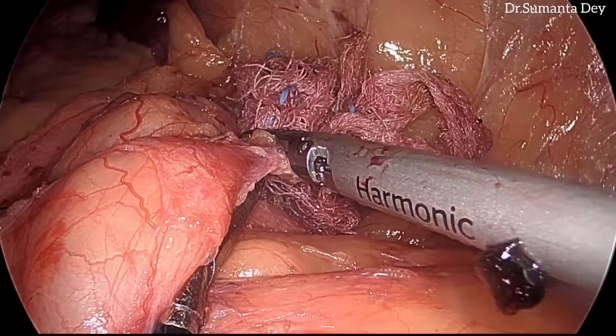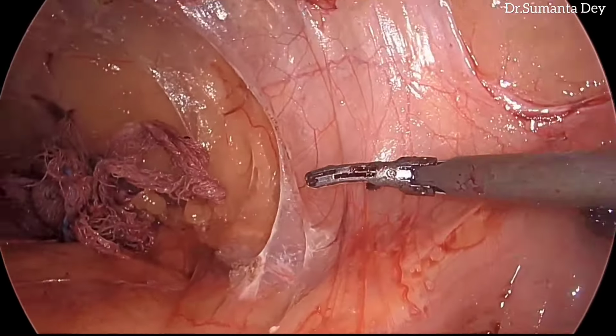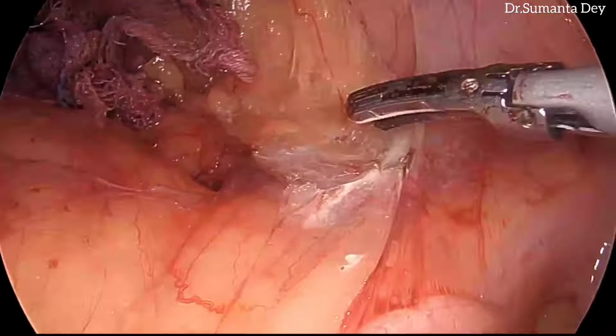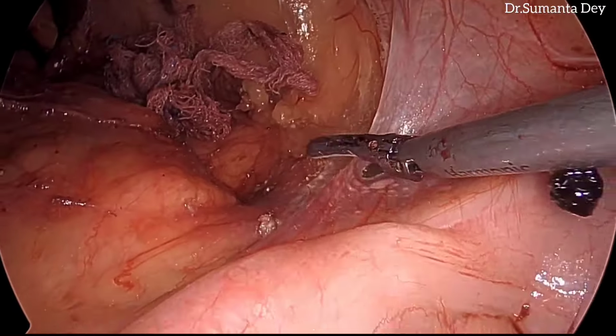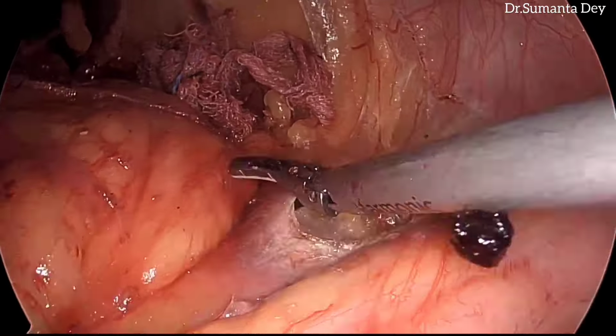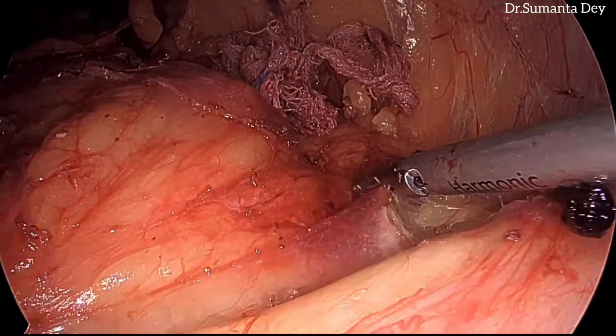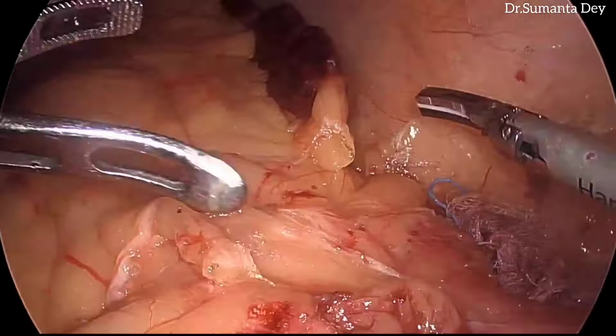So just by dividing the lateral attachments, the complete left colonic mobilization is done till the start of the sigmoid colon. Till the starting point of the sigmoid colon, it is being mobilized nicely, so that once it is completely mobilized, we can do a tension free anastomosis.